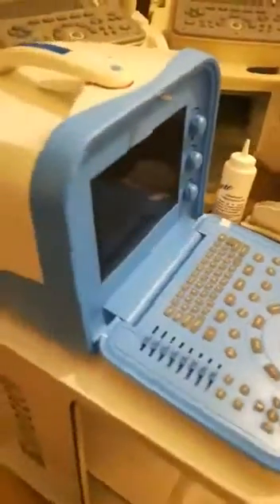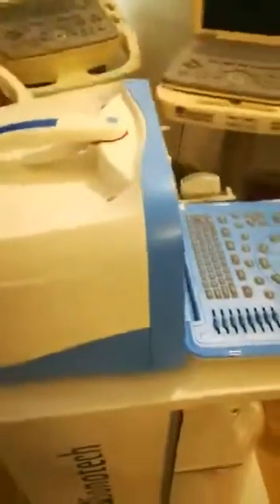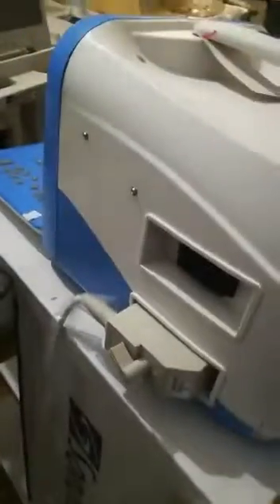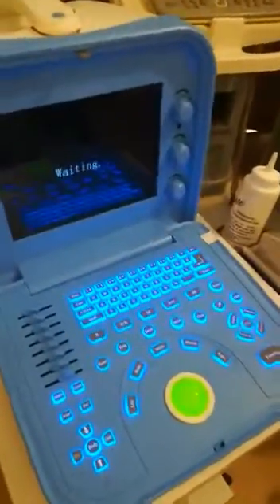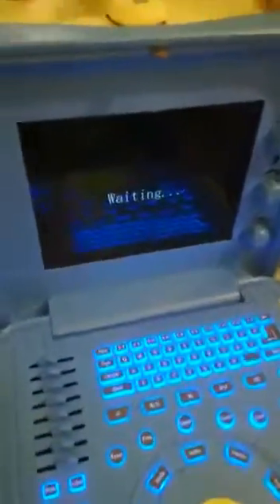That's our new product Novadex N6, portable 2-probe connector, backlight keyboard, LED display.